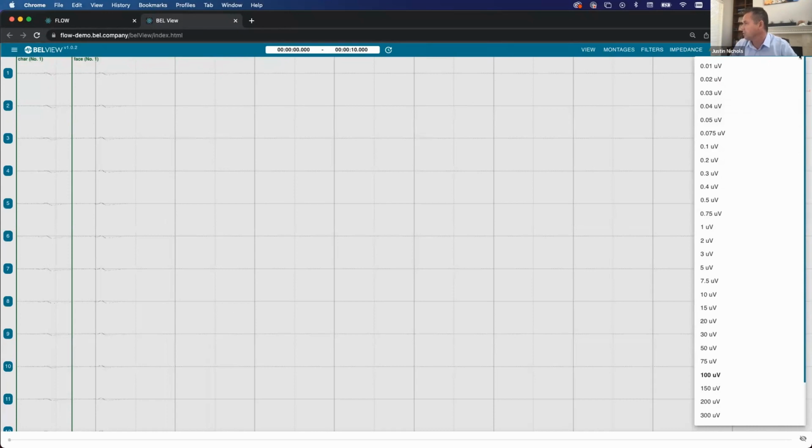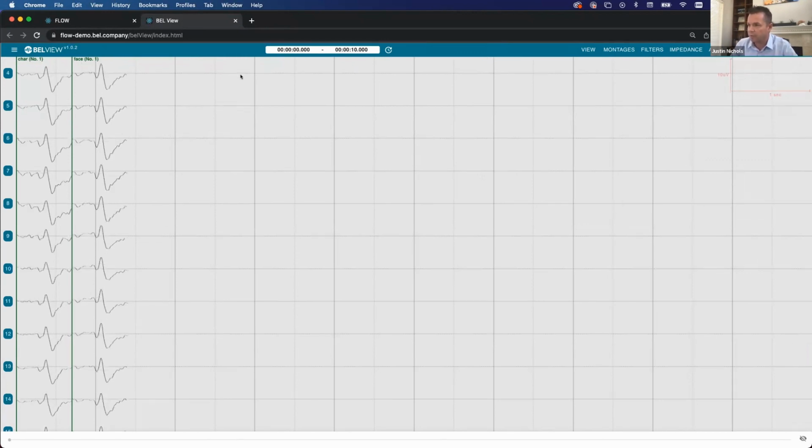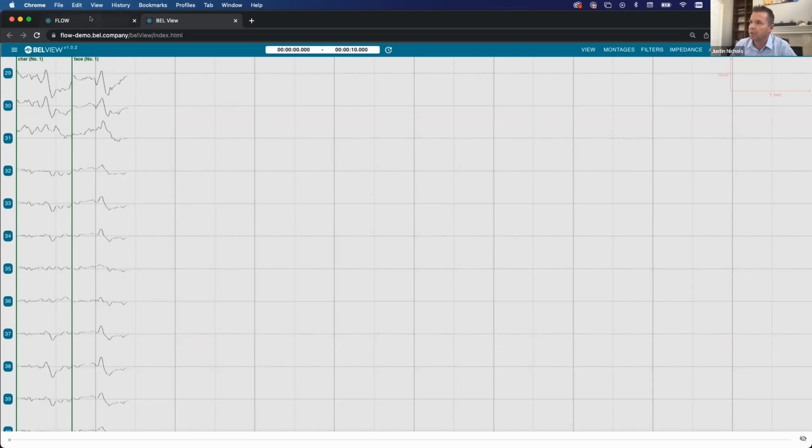So if I want to change view settings, etc., I can just change timescales, change amplitude. You can see here character versus face. I won't go into details. We've done that, but same data, all within a simple Chrome browser. Very snappy, just over the network here.